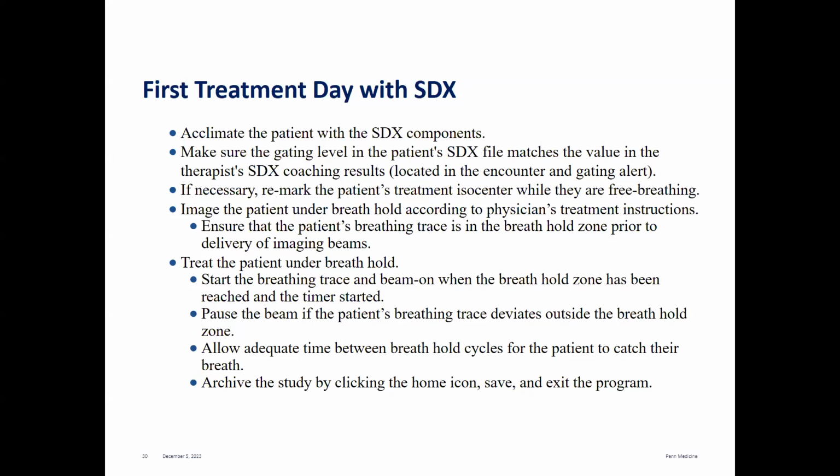Verify the gating level in the patient's file matches the value in the therapist's SDX coaching results in the encounter and the gating alert. If there's a shift and it is necessary, we usually remark the patient's new treatment isocenter while he or she is free breathing.